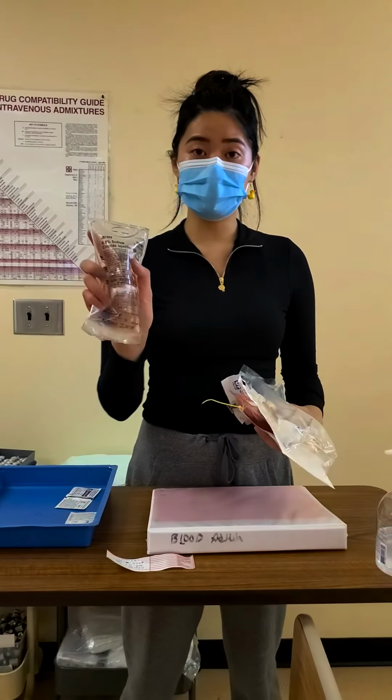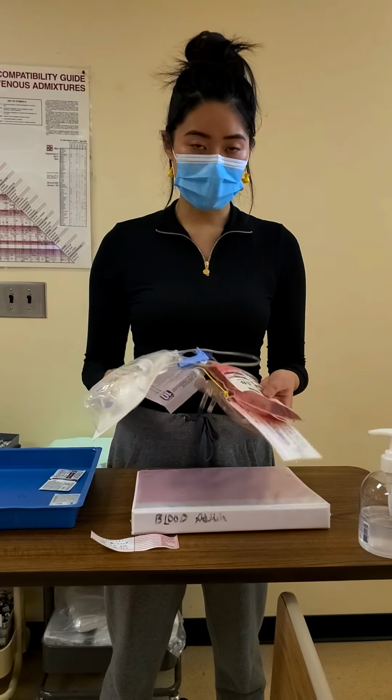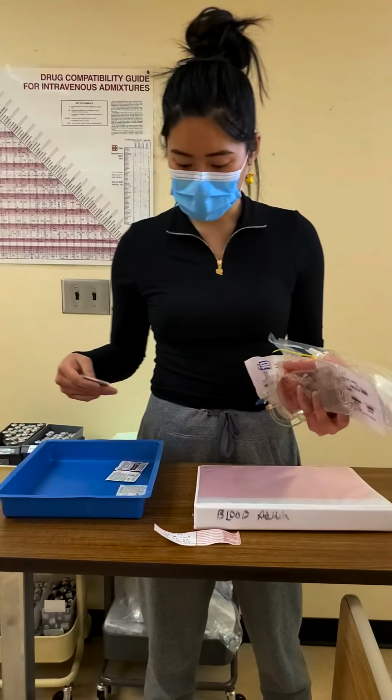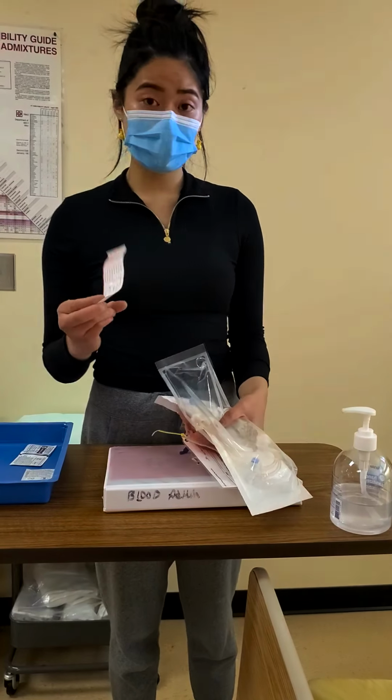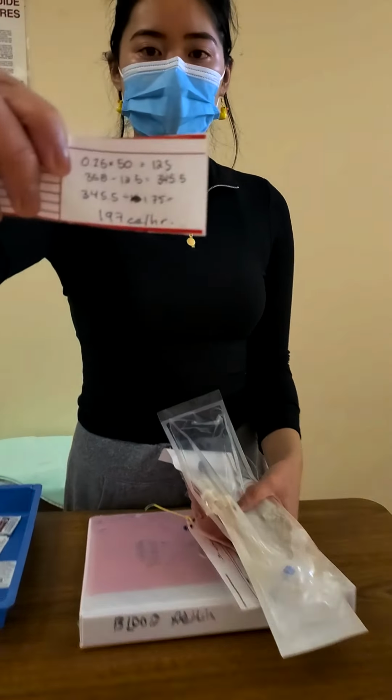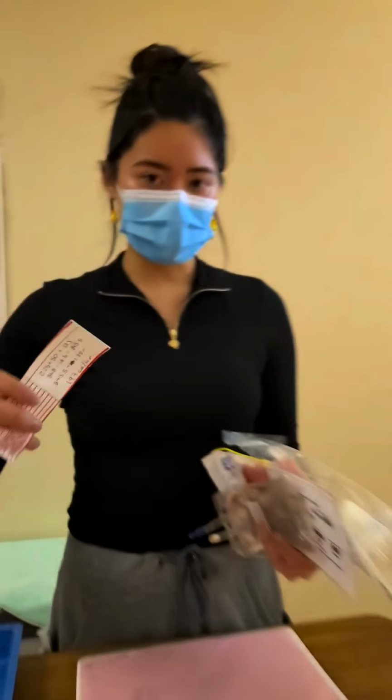So we're going to use a 250 normal saline bag to prime. We're going to use a blood tubing. We're going to have the blood. And I brought gloves, flushes, alcohol swabs. And then I also have pre-calculated my rates. So the first 15 minutes we're going to start slow, 50 cc's, and then we're going to raise the rate after that 15 minutes.